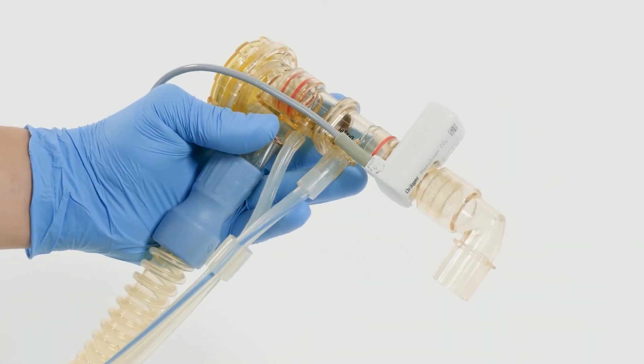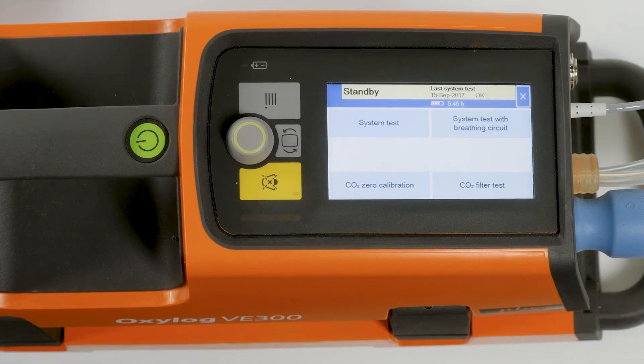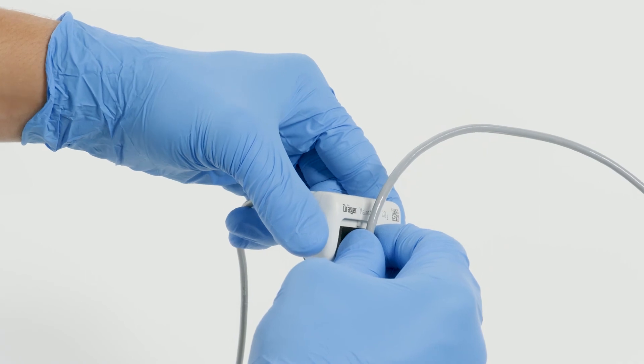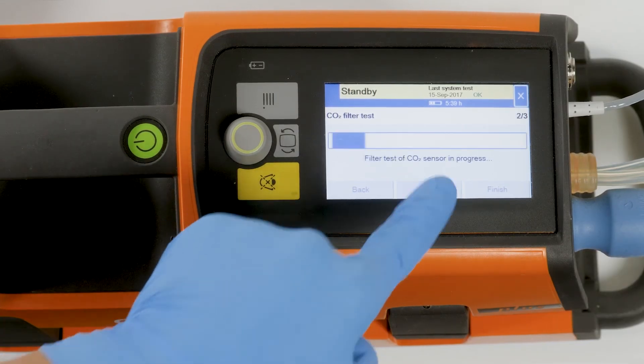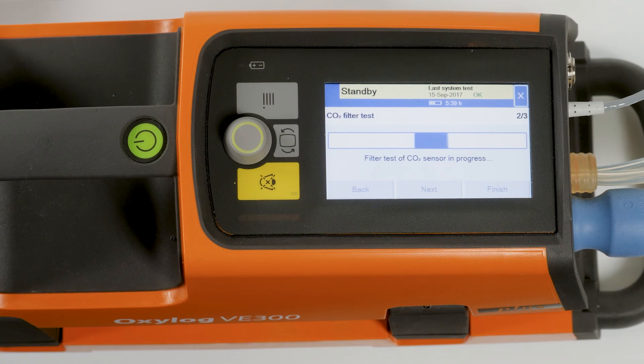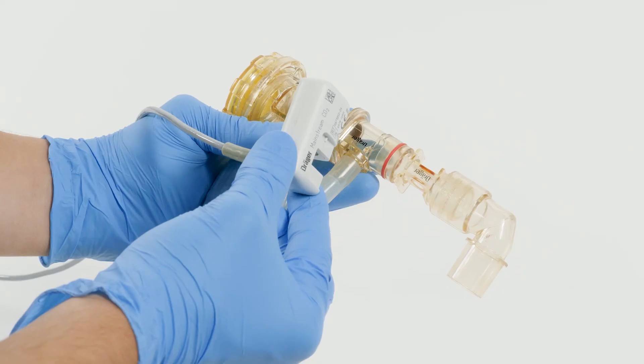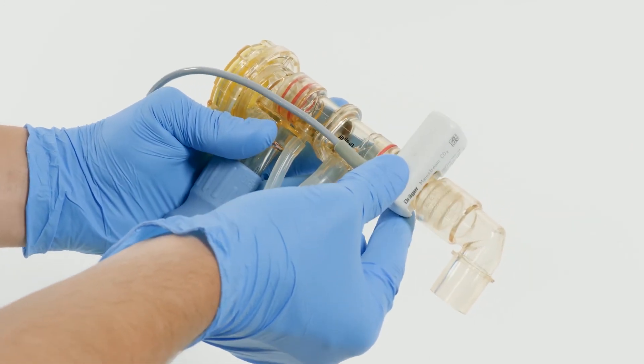Reconnect the CO2 sensor to the CO2 cuvette. To start the CO2 filter test, touch the button CO2 filter test. Confirm the messages 'remove the cuvette from the CO2 sensor' and 'attach the CO2 sensor to the test filter' with the next button. The CO2 filter test starts and the message 'filter test of CO2 sensor in progress' is displayed. A bar indicates that the CO2 filter test is in progress. When the CO2 filter test is completed, a message is displayed indicating the result. To exit, touch the finish button in the bottom right-hand corner of the screen. Reconnect the CO2 sensor to the CO2 cuvette.